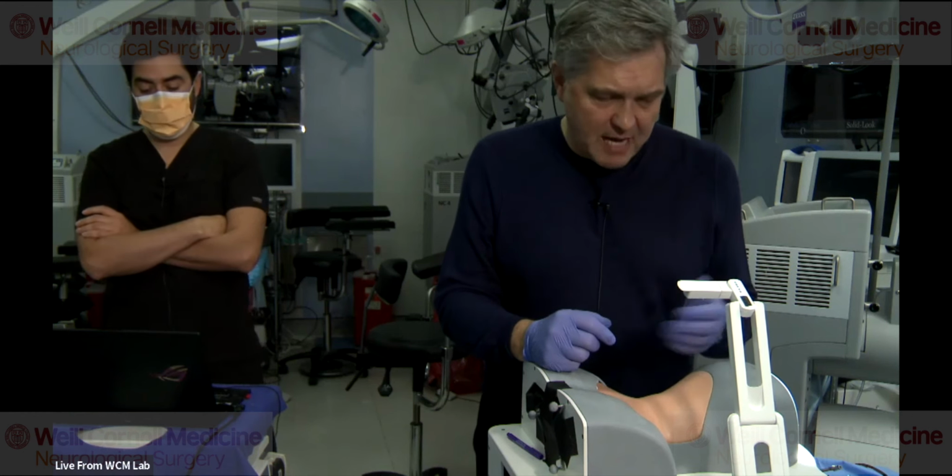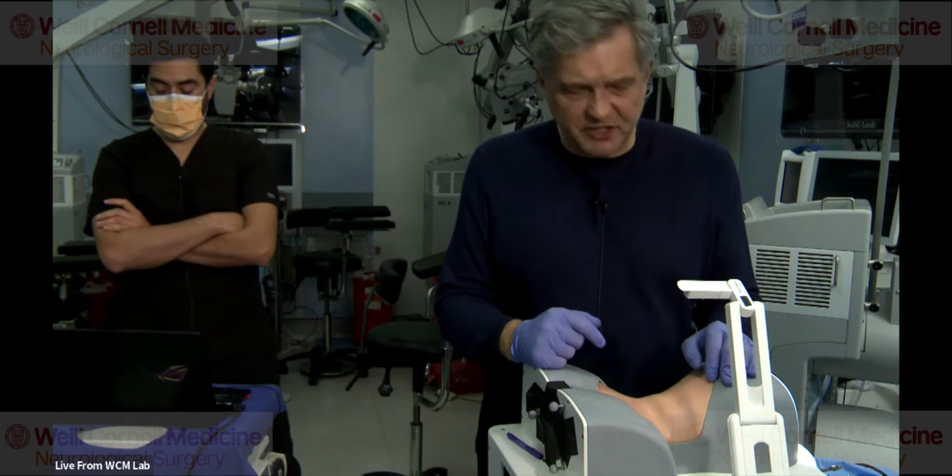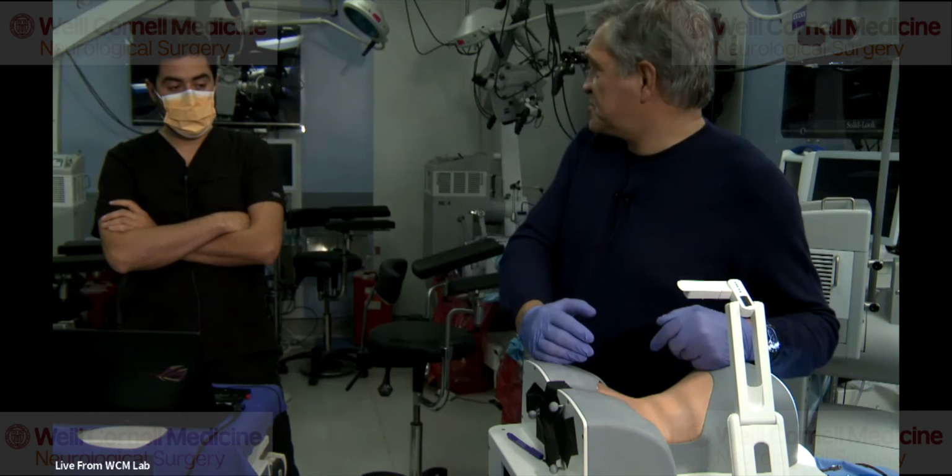Now, in this case, where we're just using navigation for localization of pathology, I would minimize the radiation to maybe only 20% or 30% of a diagnostic scan. So that's the nice thing that you can leverage with some of the newer technology. So in this particular case, we said we're going to do a left-sided C4, C5 decompression foraminotomy with a tubular retractor. So I'll just slowly get started.